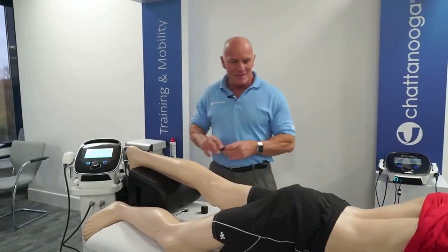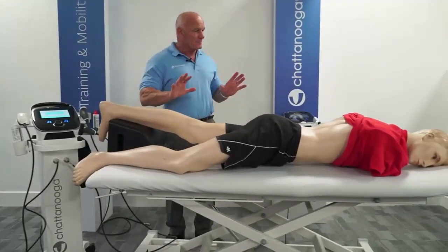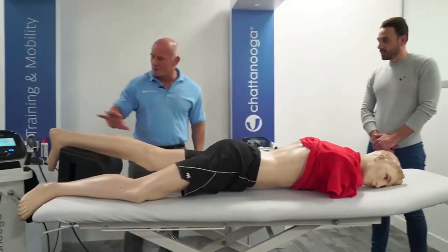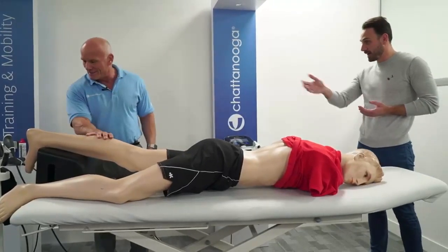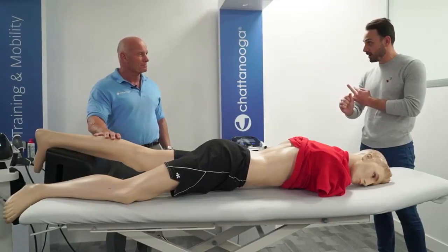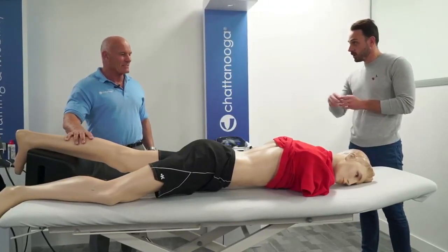Okay, so Craig. Yes. Have you got any questions? Okay, so first of all, the new machine looks great. And the new handpiece that you showed me, it's a brand new handpiece and it goes below 1 bar pressure, so you can use the new treatment heads with it as well. That's correct, yeah. What other features are new with the machine?